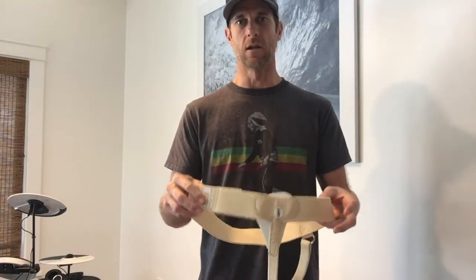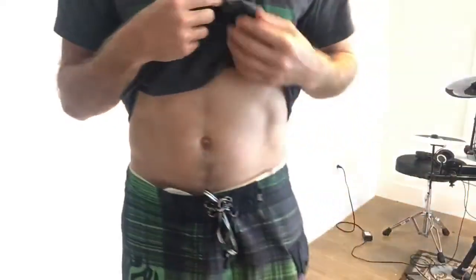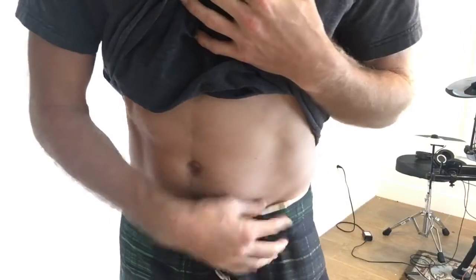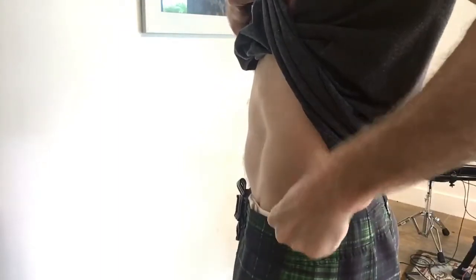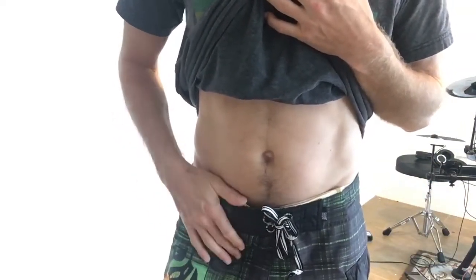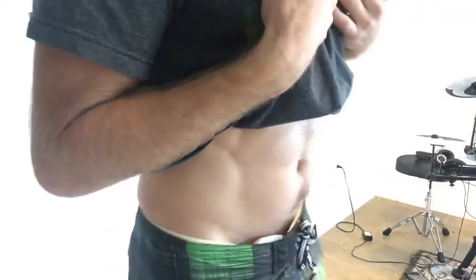I'll put it on underneath the surf trunks so you can get a better look at what it looks like when it's actually on. Here it is underneath the surf trunks — you can see it's already pushing out the surf trunks pretty good on the front because of that big adjustment Velcro, how thick it gets up there, and that big bulky pad. Around the back it wouldn't be too bad, but just that front — the way it sticks out like that — that wouldn't be good. And honestly, the pad is digging into where I have the hernia so bad that I almost can't even keep it on right now because it hurts, because that pad is so hard.